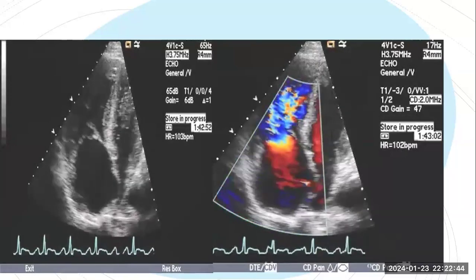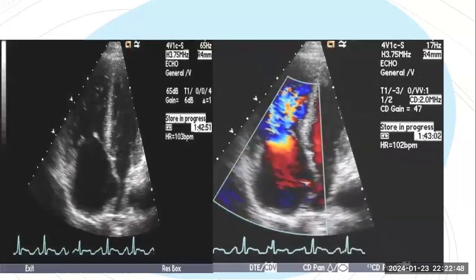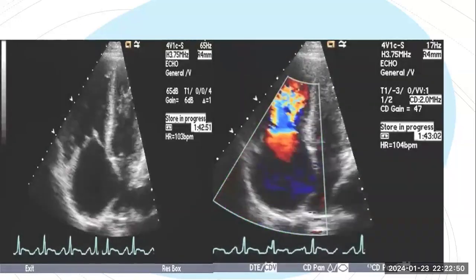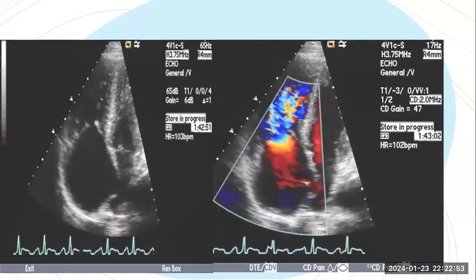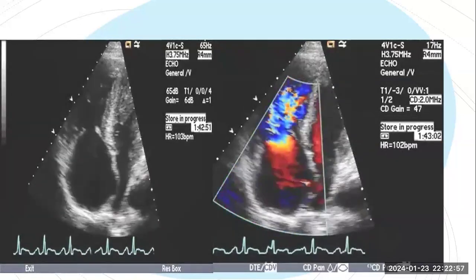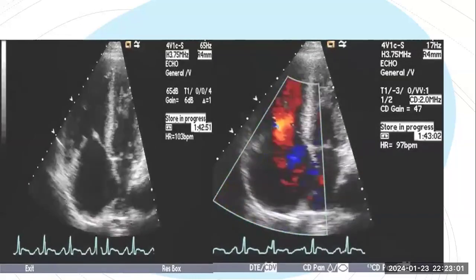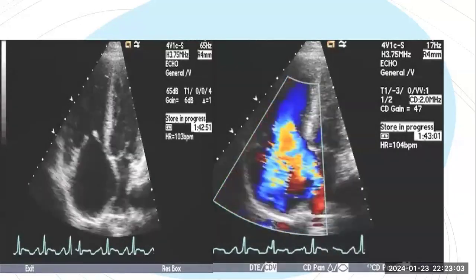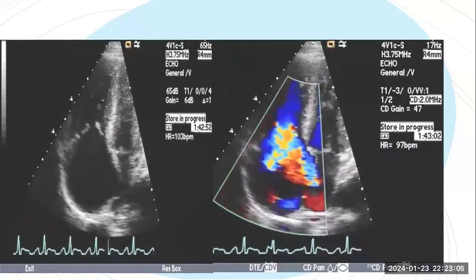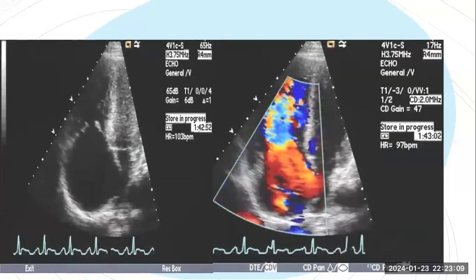But why did you say carcinoid? What do you usually see in the leaflets of the tricuspid in carcinoid disease? Thickened. Yes, thickened. So it's not far away or displaced. It's just fixed, thickened, with failure of coaptation, a very huge coaptation gap between the leaflets, and open TR, as we could see here. Am I right?